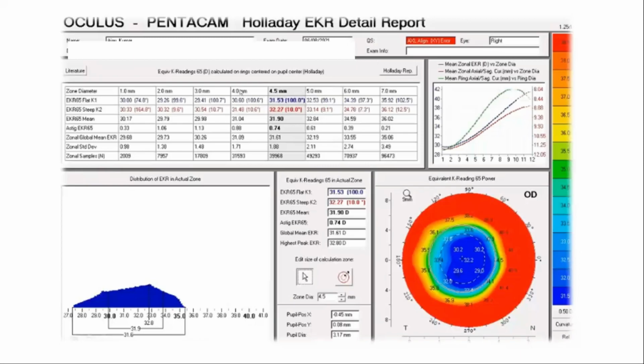And yes, of course, it does give you the angle kappa, but I don't know if it gives you the angle alpha. I'm not very sure. But angle kappa I've seen for sure it gives you. And in cataract pre-op display, we have angle alpha too, sir. But in Pentacam AXL, it's there. But I haven't checked in our Pentacam basic and HR.